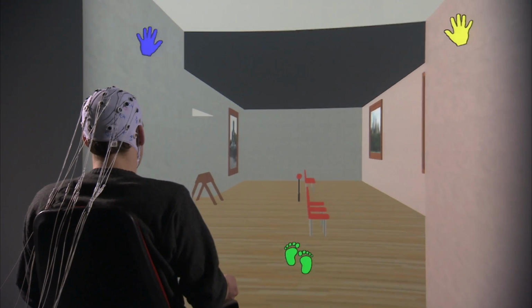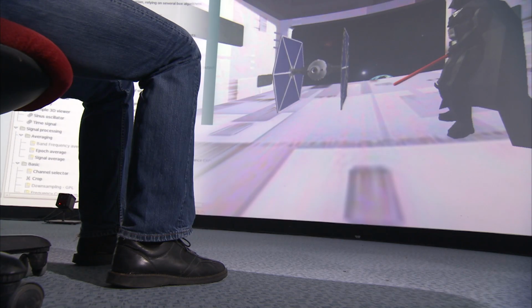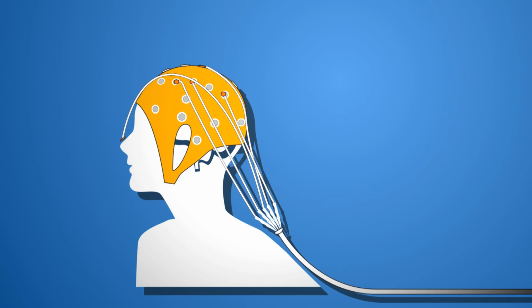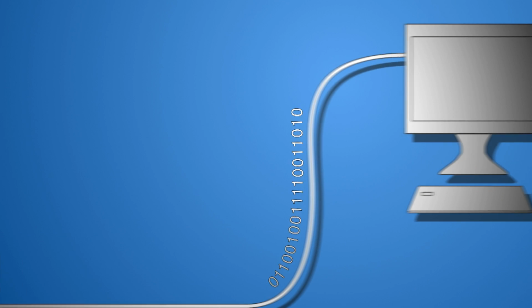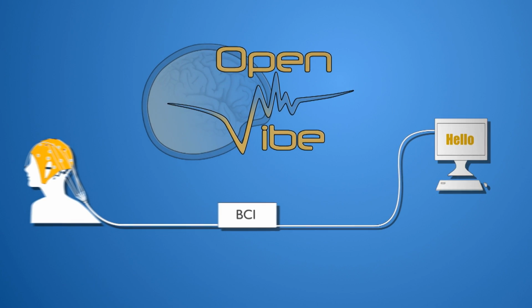To facilitate the integration of brain-computer interfaces and the handling of commands by thought in virtual reality environments, we have created OpenViBE software. A brain-computer interface, or BCI, is a new means of communication that controls or monitors computers and machines directly using brain activity. The brain activity is measured by electroencephalography, or EEG, using electrodes located on the surface of the skull. The BCI analyzes brain signals in real time and can identify specific mental activities for use in operating a machine or computer.